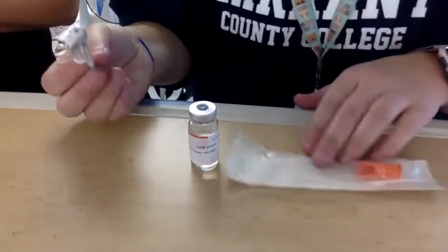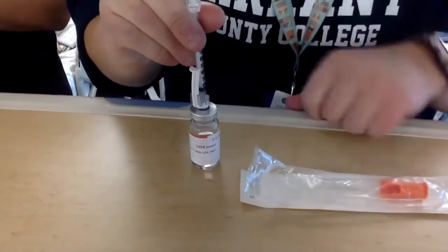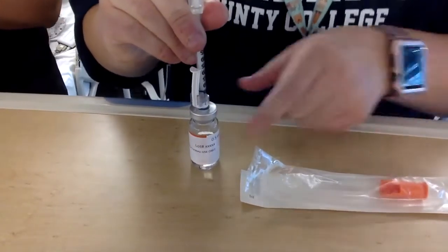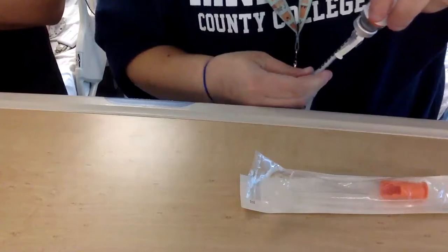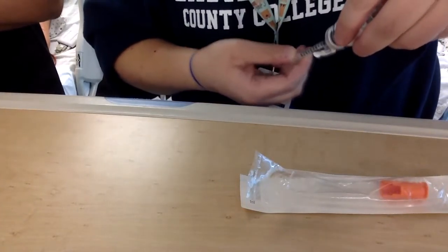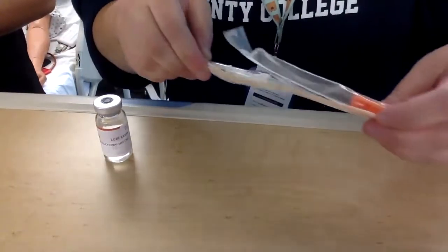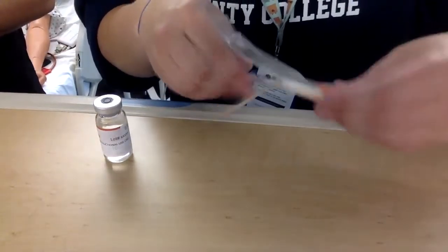So I pull back 2 units of air, then I'm going to inject. If this is clean, I do not have to swab it off. And then, as I did before, I'm going to pull back just those 2 units. All right, so I have that there. And then I am going to make sure that everything is clean and sterile.